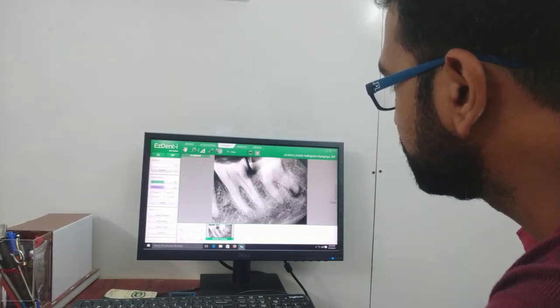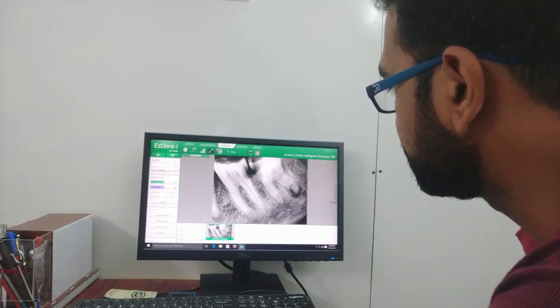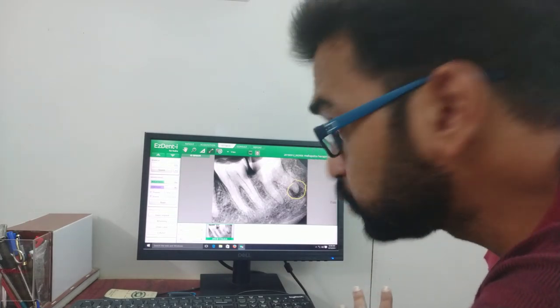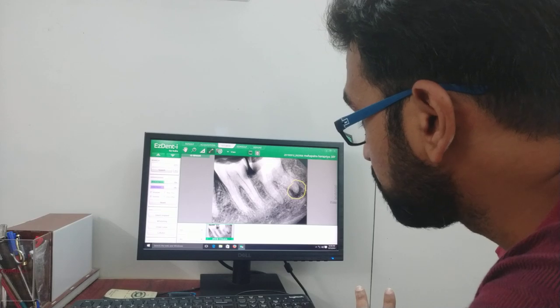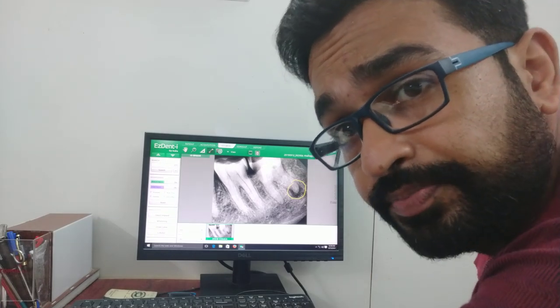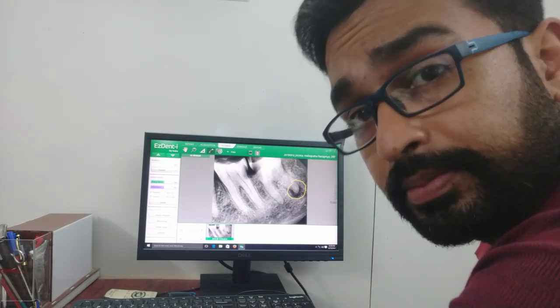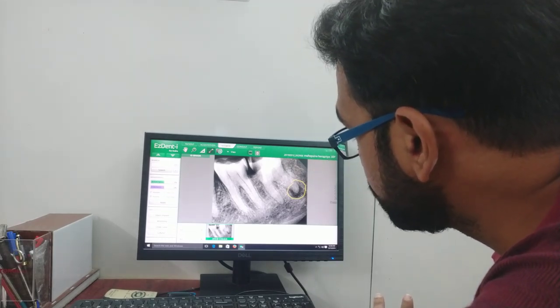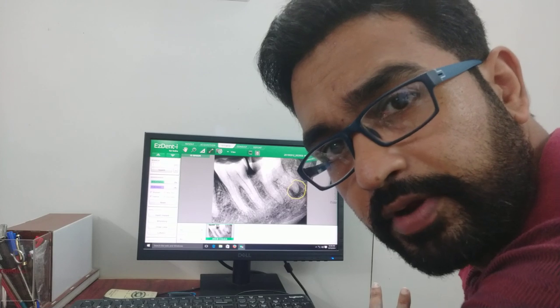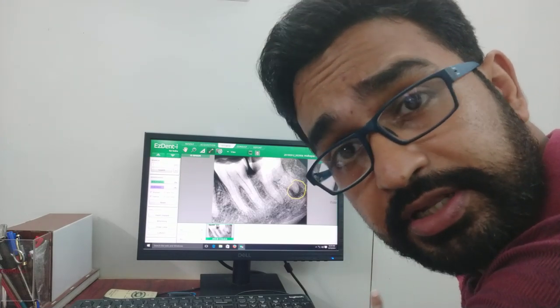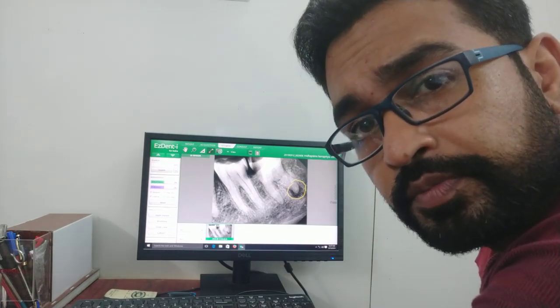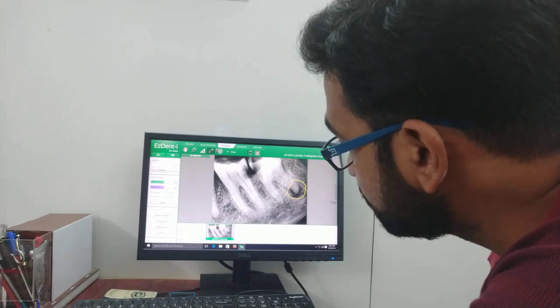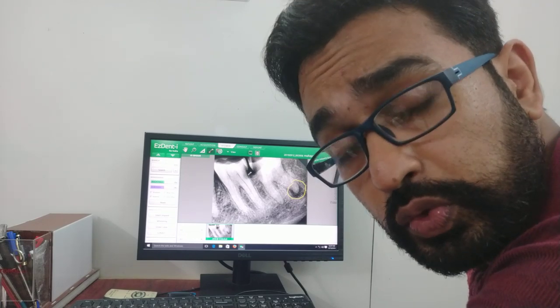This is a periapical lesion here, and this tooth was carious from the proximal end as you can see. But the question — the dilemma — is: if I extract this tooth, the patient will still have pain. Do you know why?